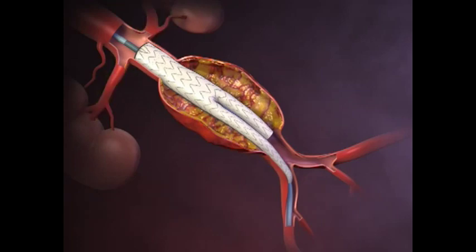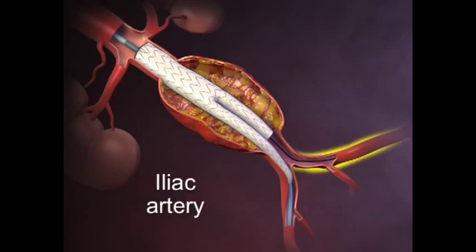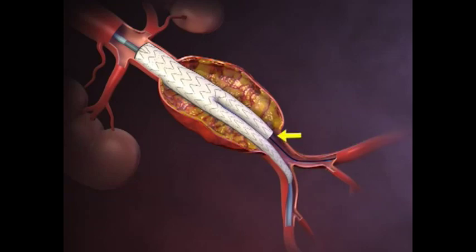A second guide wire is introduced through the contralateral iliac artery into the open lumen of the contralateral limb of the stent graft. The top cap is removed, deploying the suprarenal stent and anchoring the stent graft to the vessel wall.